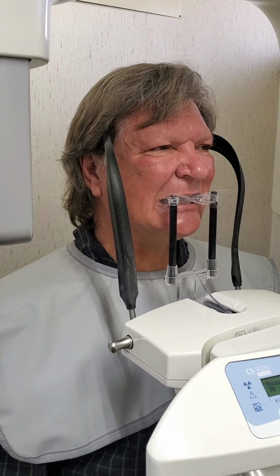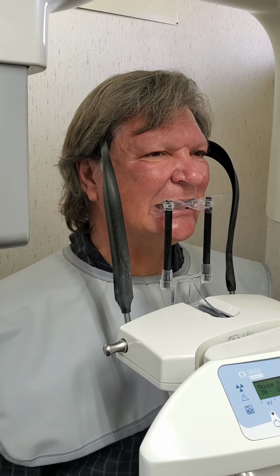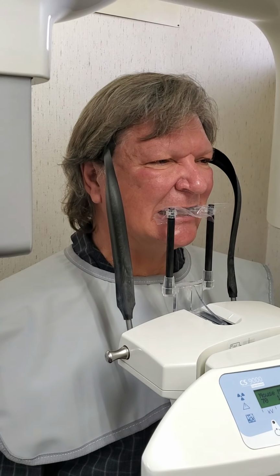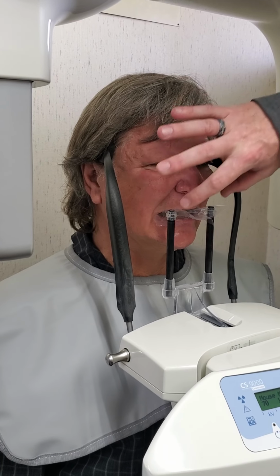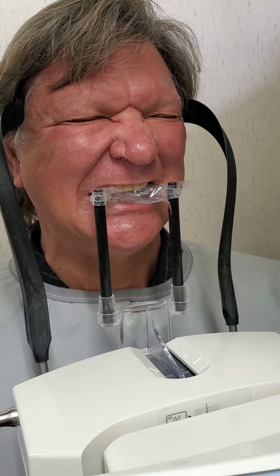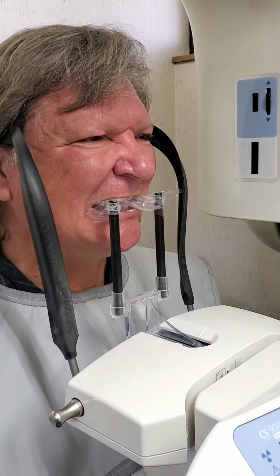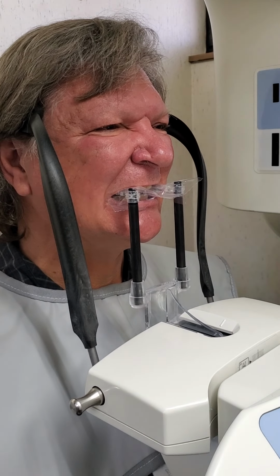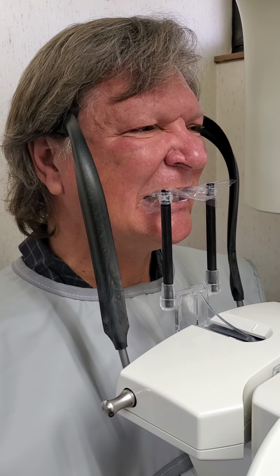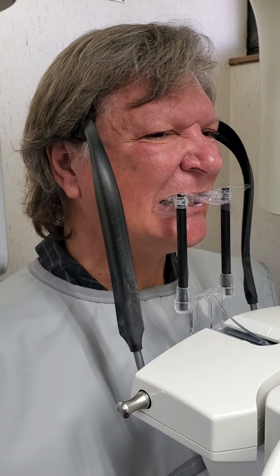So if you're doing bottom teeth and you have them smile, that's when you want to look at their bottom teeth. Okay. If you get them in the machine and you have them smile, and now you can see that the plane of the teeth is angled down, all you have to do is bring that back up, just a skosh. Okay? You don't want to adjust the chin rest, you want to adjust the whole machine. Okay?